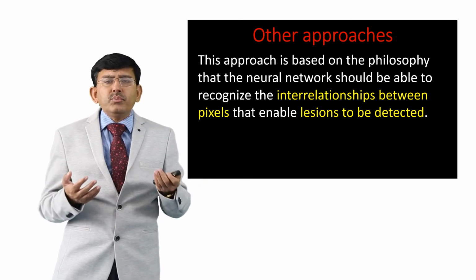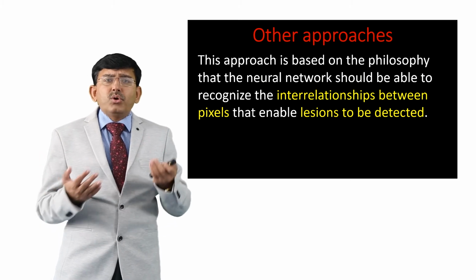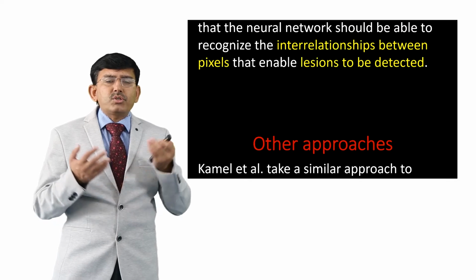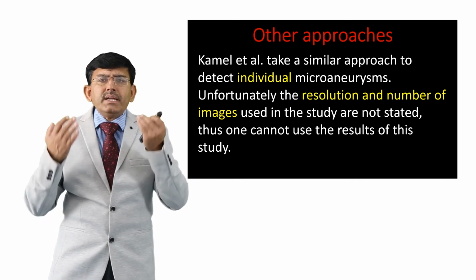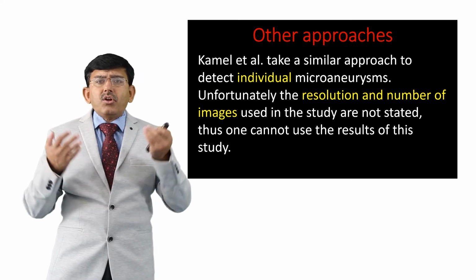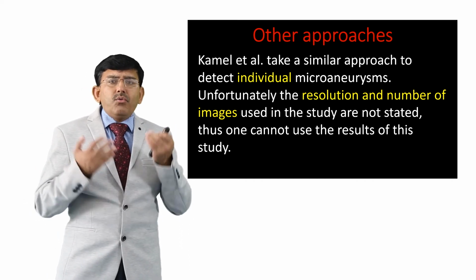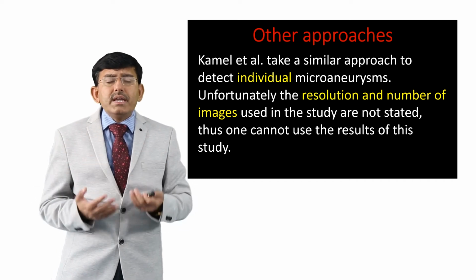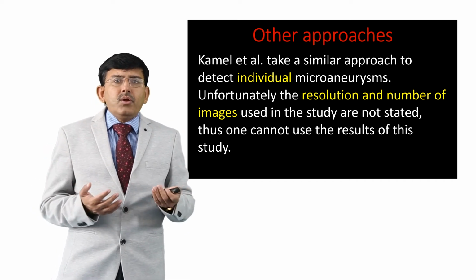Kamel and his group take a similar approach to detect individual microaneurysms. Unfortunately, the resolution and number of images used in the study were not stated. Thus, one cannot use the result of this particular study for comparison.